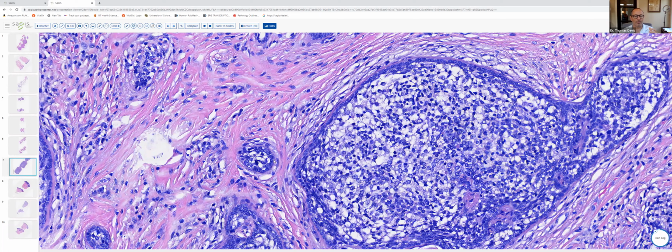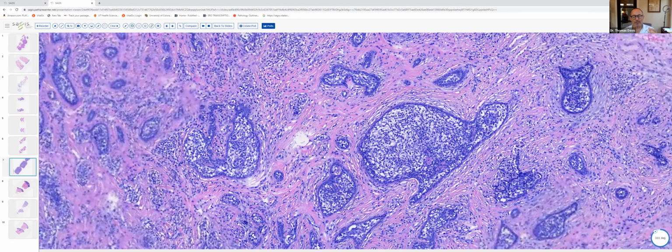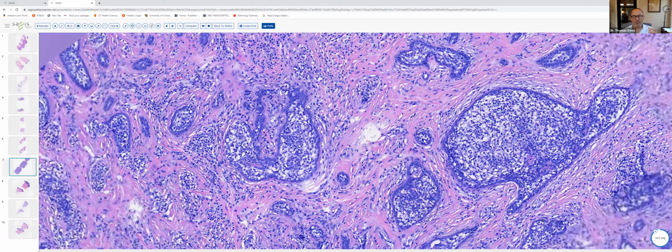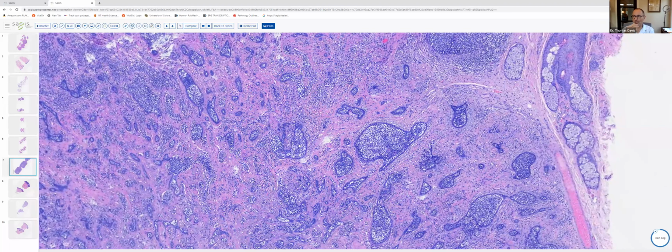So let's look at another one. Again, we can see the centrally located clear cells and a sprinkling of lymphocytes. And this constellation of features is characteristic of an adamantinoid trichoblastoma or cutaneous lymphadenoma. They all look like this. The makeup of the aggregates is similar. They're all embedded in a very fibrotic stroma, and they're characterized by this marked variability in size and shape.